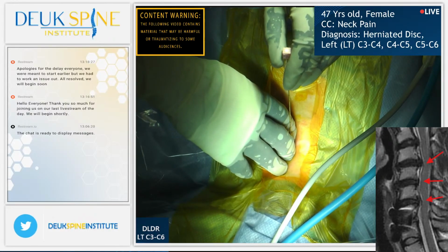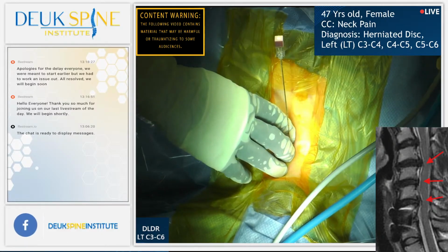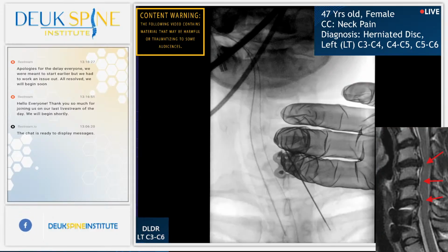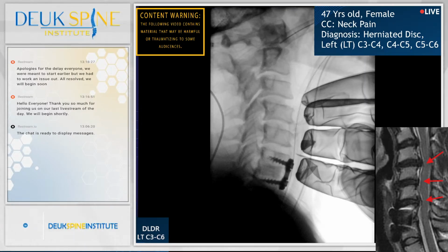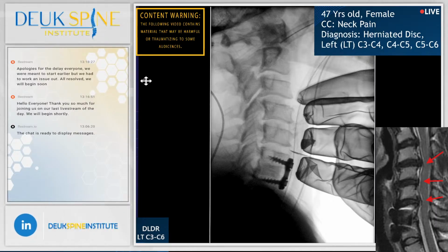All right, AP. Looks good, lateral. I'm placing the needles right now. The first needle will be right above her fusion.